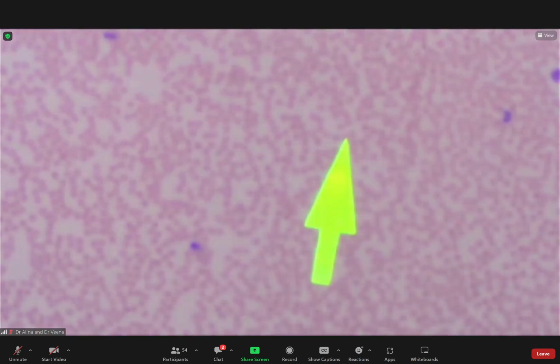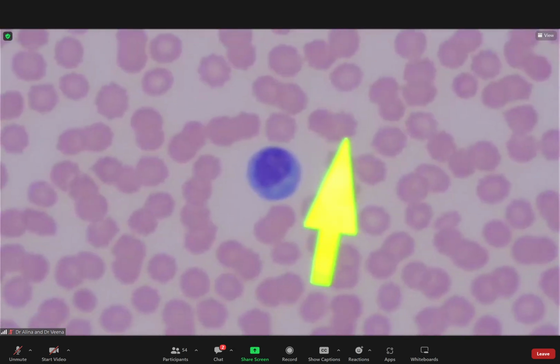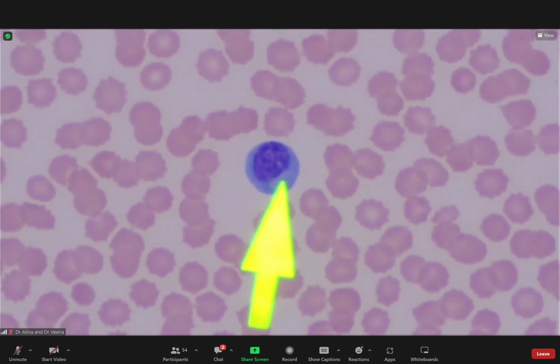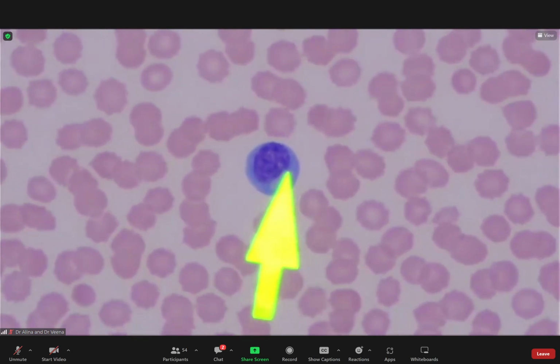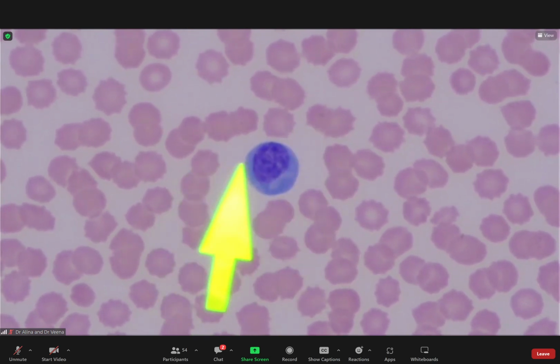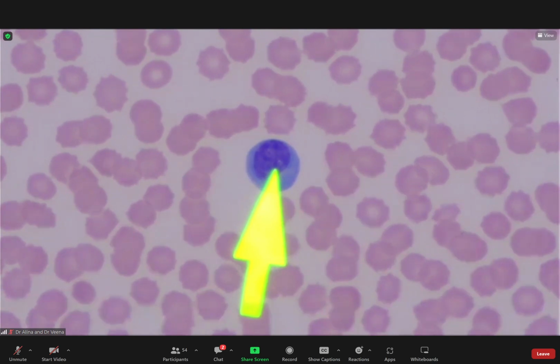Very erythroid? Your erythroid will not be that blue. M7, M6. Sorry, I got an M6. Look at that. No lah, your erythroid leukemias will not be this blue lah. And you won't get this perinuclear halo. You get this typical nuclear features. It's a very eccentric nucleus. The nucleus is not an M6 nucleus.